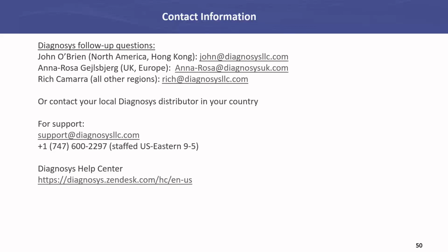Natalie, do you want to? I forgot I muted myself. Yeah, so I don't have a ton of experience with other manufacturers in exporting their raw data, so I wouldn't want to speak to that. I will say that creating protocols with our equipment, or at least updating and modifying them, is significantly easier and significantly faster with our equipment than with some of our closest competitors.